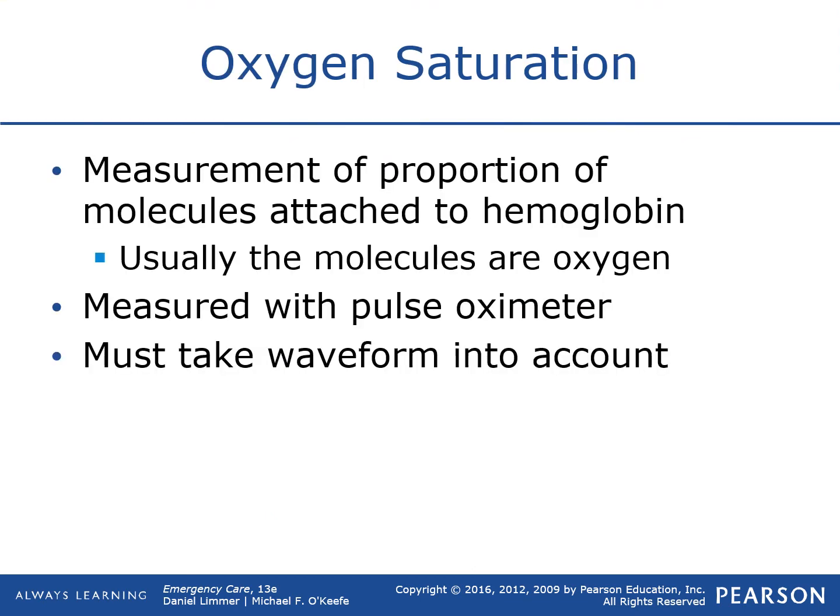So moving on into oxygen saturation. Now I mentioned oxygen saturation in our airway management section, section 2. It is a wonderful tool. It is not the end-all be-all of patient assessment or patient care. So oxygen saturation measures the amount of molecules that are attached to hemoglobin. So remember, hemoglobin are molecules on the red blood cells, and those are the magnets and carriers for oxygen. So the vast majority of the time, if a molecule is attached to hemoglobin, that molecule is oxygen.